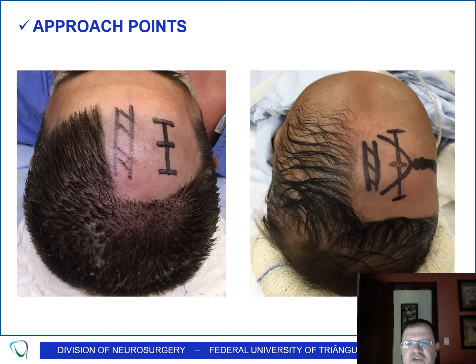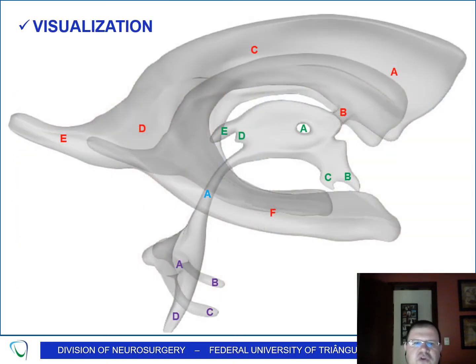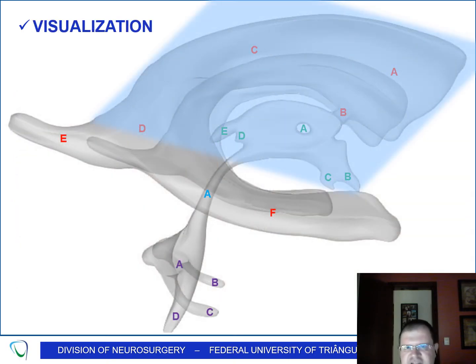The main regions of the ventricles we can see are these: most of the lateral ventricle, the frontal horn, body and atrium, the foramen of Monro, and the majority of the third ventricle, except the roof of the third ventricle.